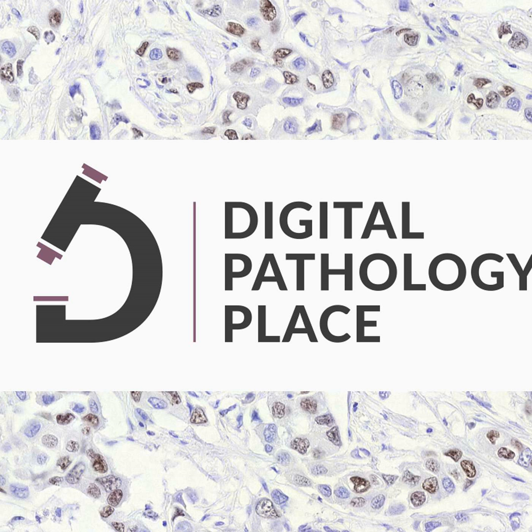Yeah. But if you have a not so perfect slide, the image that you're going to generate is not that perfect. You have to read through the artifact, ask for a rescan, ask for rework. If you are working with digital in mind, then you focus, and it doesn't cost you any more work. It's not that the technicians in the lab need to spend half an hour more to prepare better slides. No, they just know it's going to be scanned. It has to have specific quality.